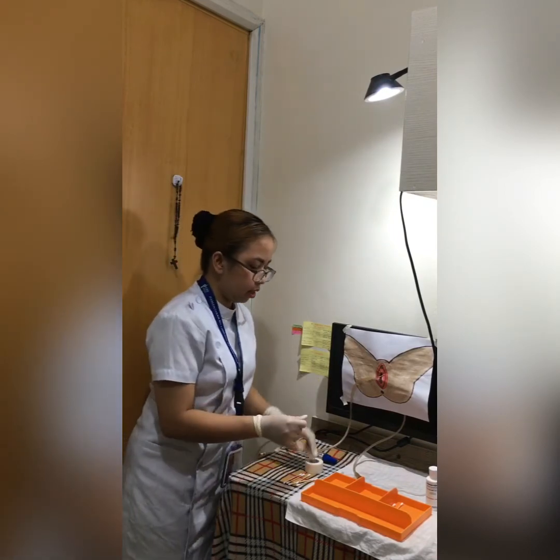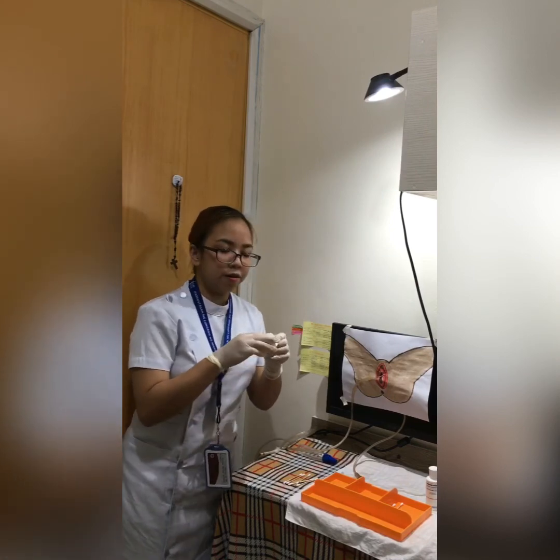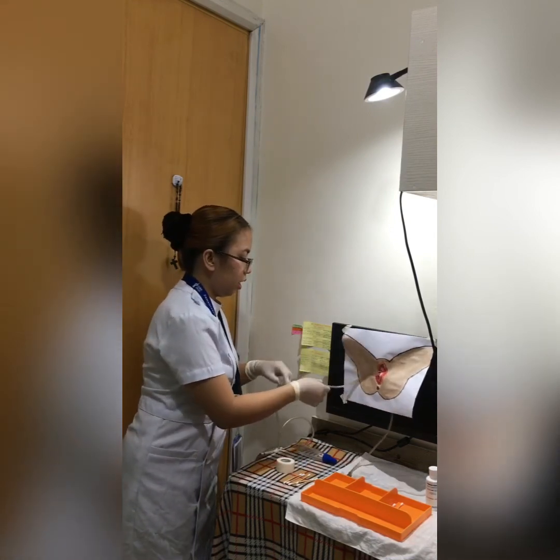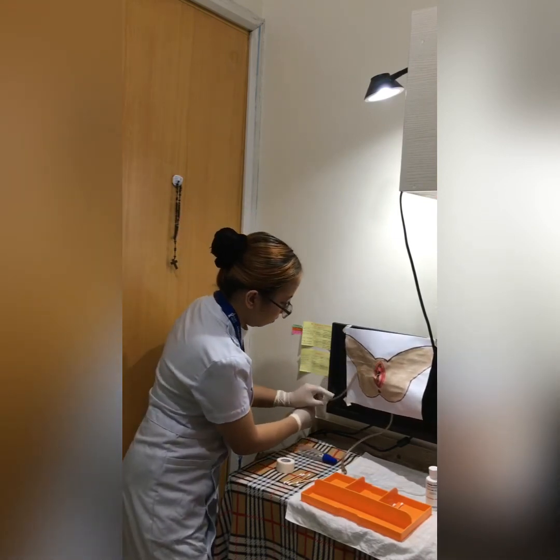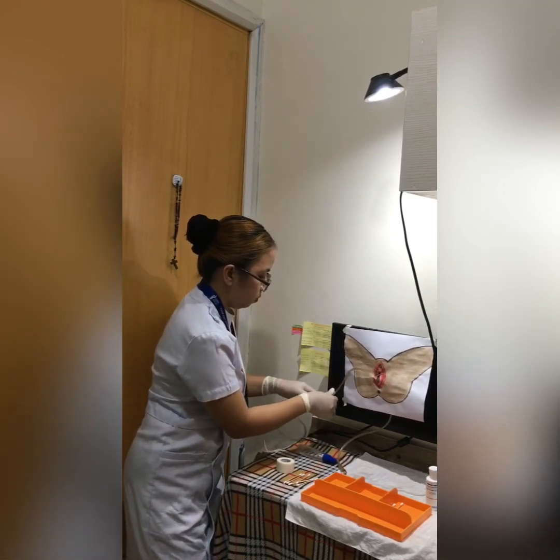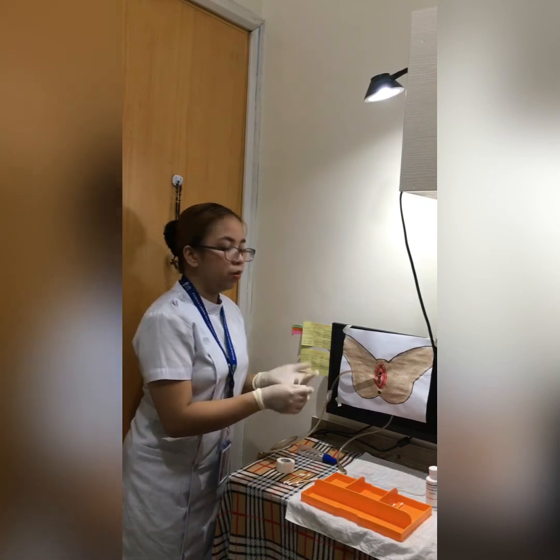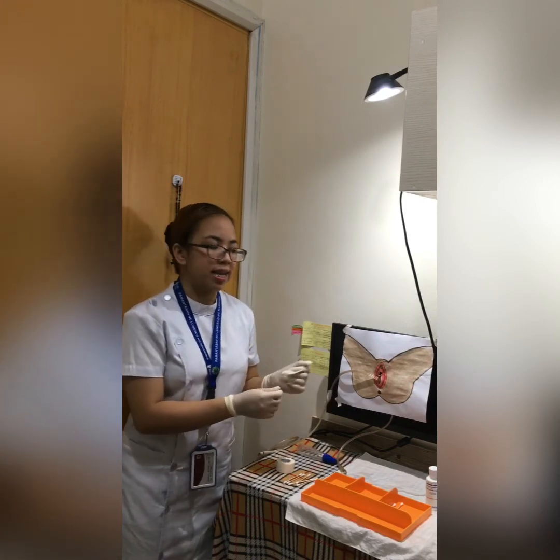Secure the catheter on the inner thigh of the client using a non-allergic tape. This is to avoid the urine from backflow or that may cause discomfort to the client.